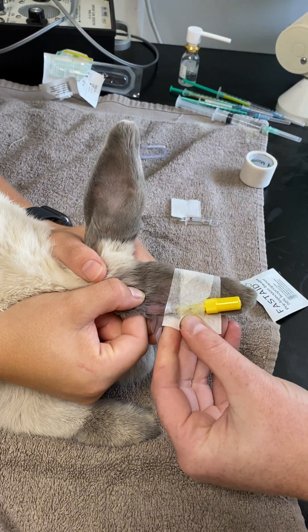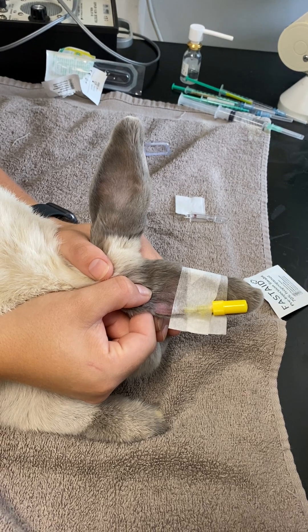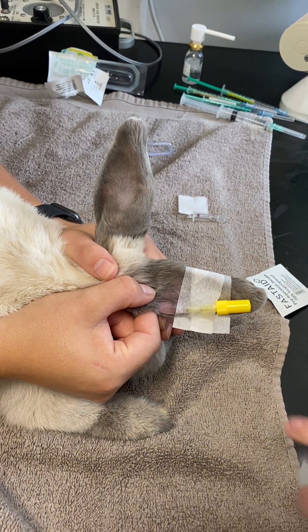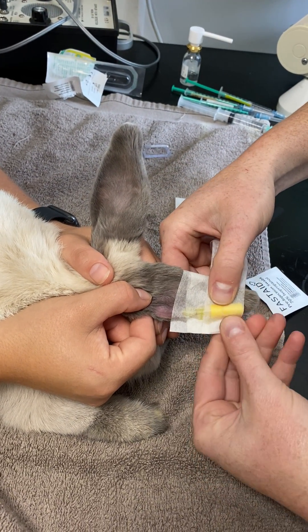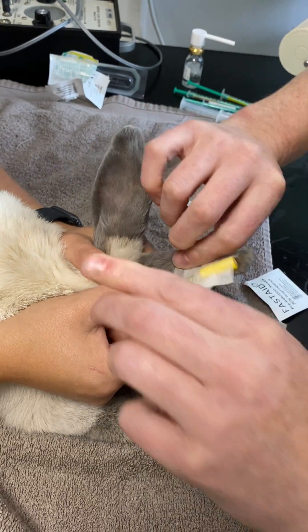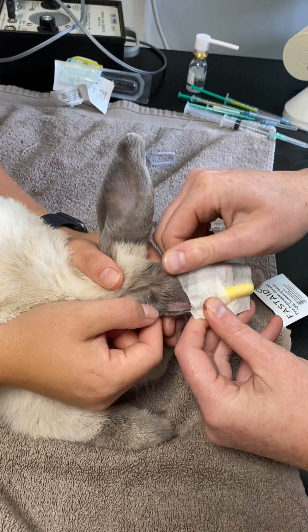The second bit of tape is going to go over the top of that. We're going to pop this over the top like this, again using our tab as our anchor point, gently wrap that around the ear — and there we go, it is all in place. And that's it.